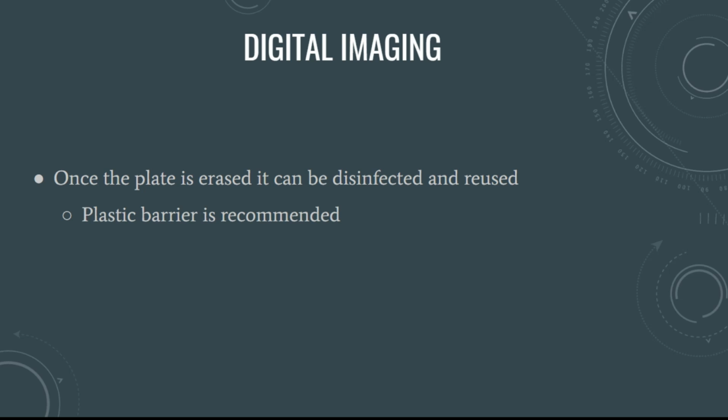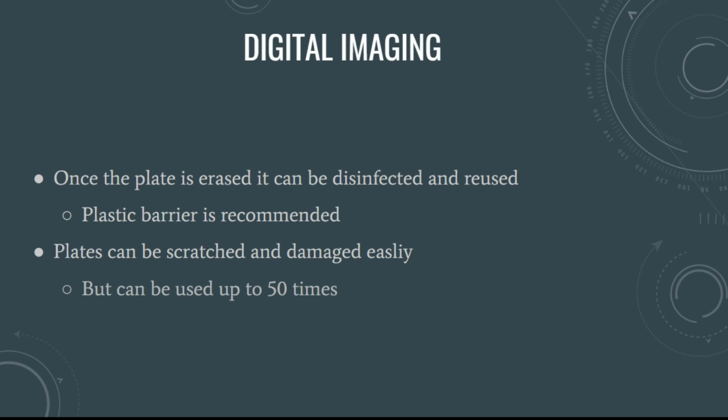And to help with infection control, they do make little plastic barrier envelopes that you can slide the PSP plate into. But you have to be very careful with these because they can be scratched and they are very easily damaged. But each plate can be used up to 50 times.